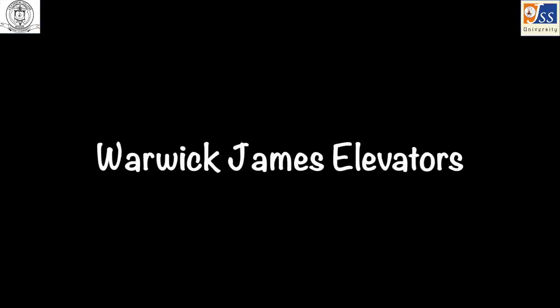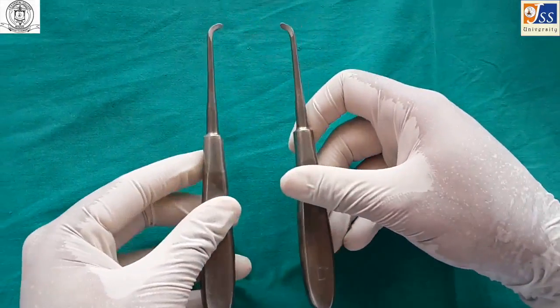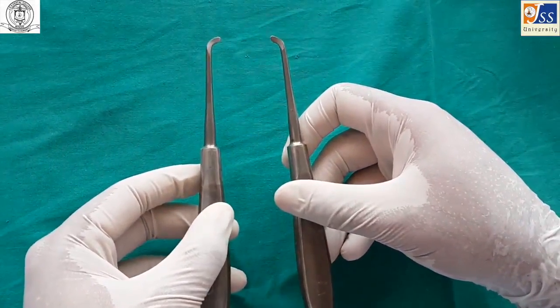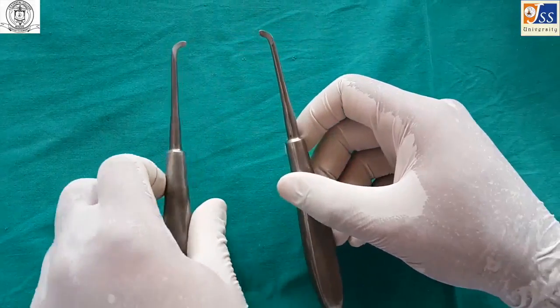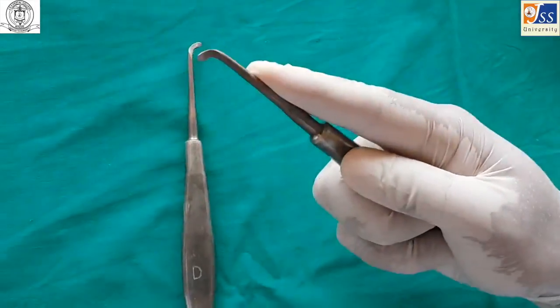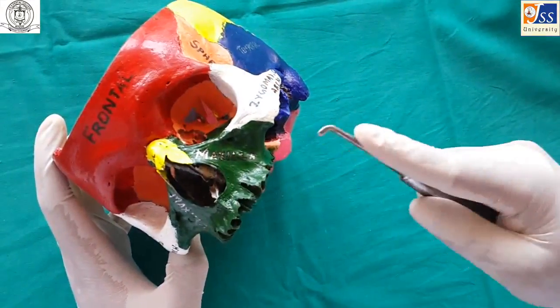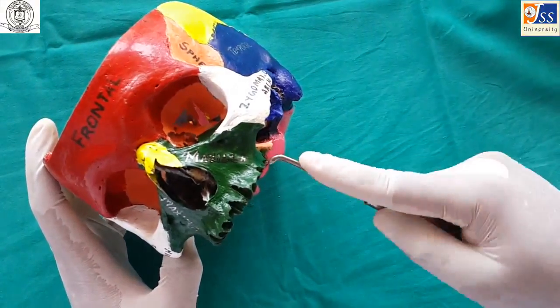The Warwick James elevator is a paired instrument for right and left sides. Curved and straight varieties are available. It is usually used for third molar extraction.